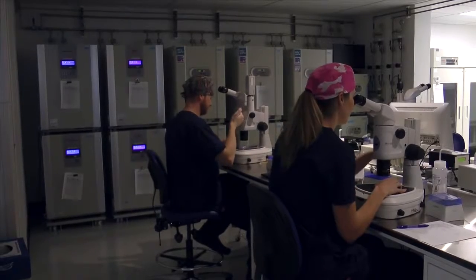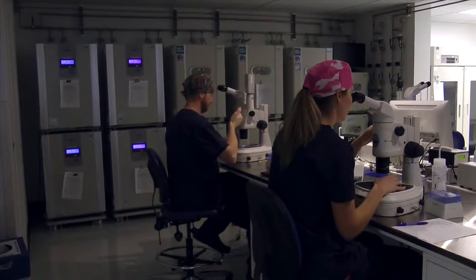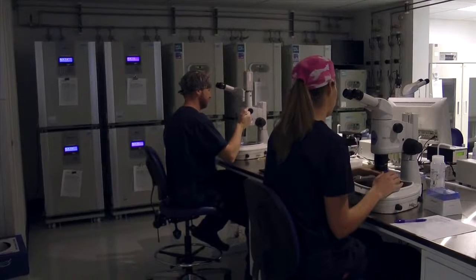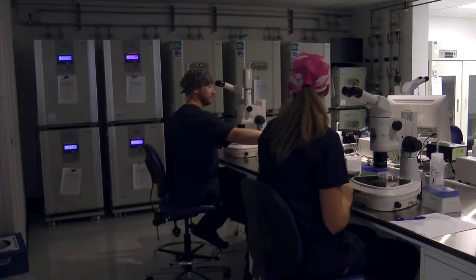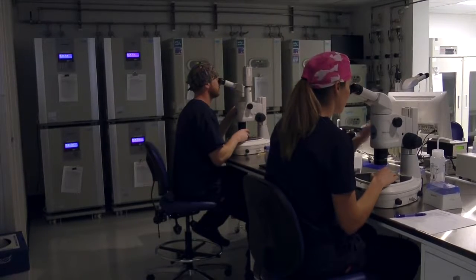One of the aspects of the MEA test that we've designed is to optimize the test. Now, by optimizing it, what we're really talking about is creating an extremely stressful environment for these mouse embryos to grow. By removing the compounds that are typically in the media that help support embryo development, we can start to see the effect of the toxic compounds, specifically in the raw materials, and that allows us to eliminate them and deselect them so they're not part of the manufacturing process.